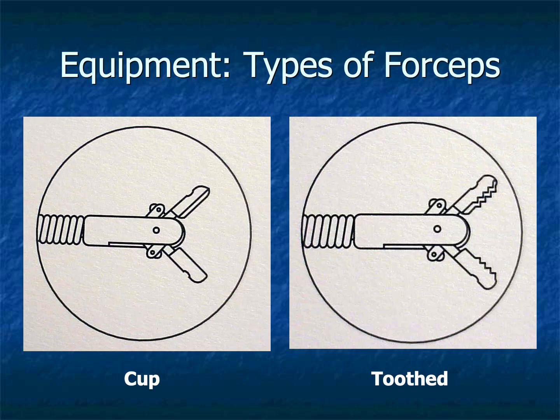Most biopsies are obtained using either cup forceps or tooth forceps. The choice of forceps influences specimen characteristics, but is only one component of successful tissue acquisition. Large forceps generally obtain larger specimens, while toothed or alligator forceps may increase tissue disruption. Operators should become familiar with the advantages and limitations of each accessory instrument.